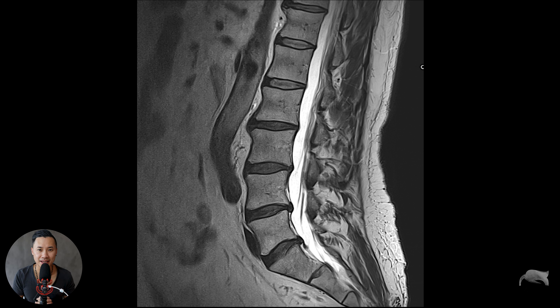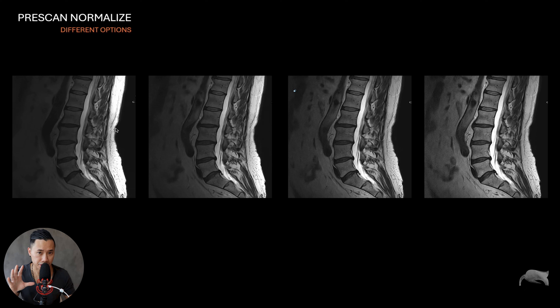It's very easy to show this with spine imaging, so I'm going to show the benefits of having pre-scan normalize on or off and the different options. As you can see here, it goes from very bright near the coil — which is the spine — to very dark in front, then a little bit better, and even better. The different pre-scan normalize options are: off, moderate, normal, and broad range.